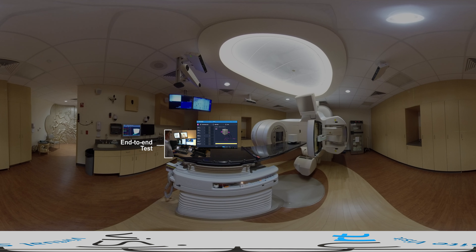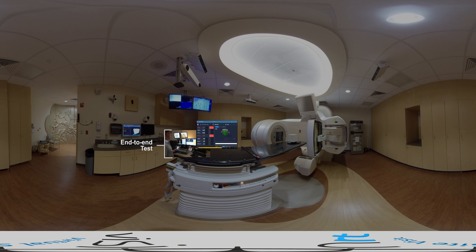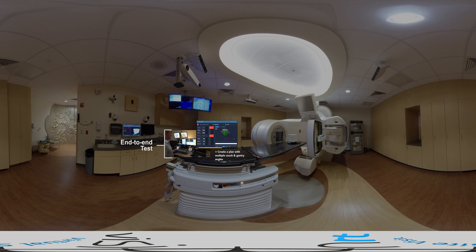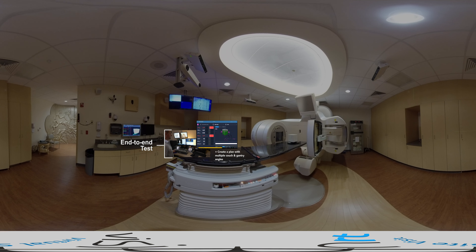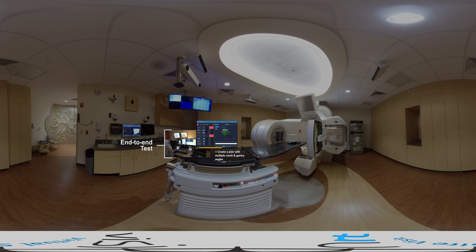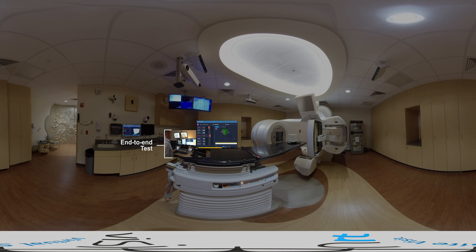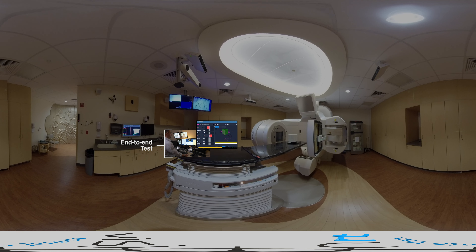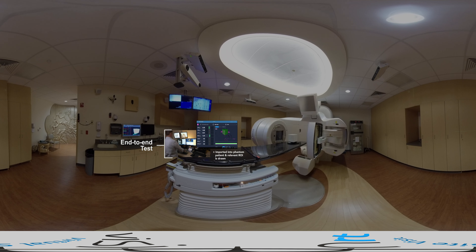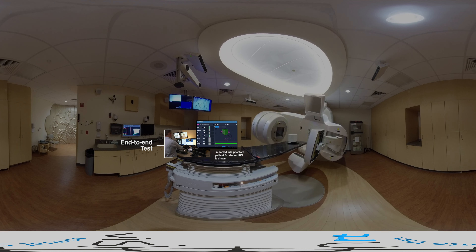The CT dataset is sent to our dosimetrist, who, treating the phantom like a patient, contours the external surface and internal spheres, and creates a plan with multiple couch and gantry angles. The plan and structure sets are sent to the AlignRT workstation, where they are imported into a phantom patient, and a relevant ROI is drawn.